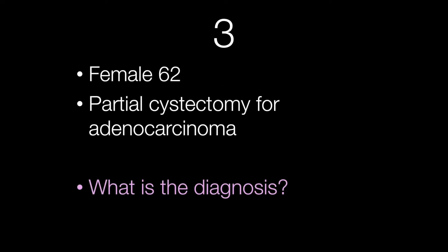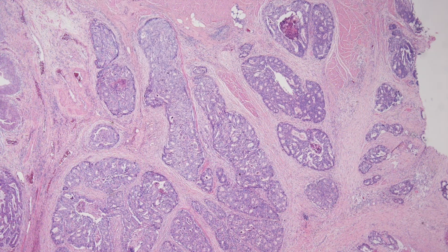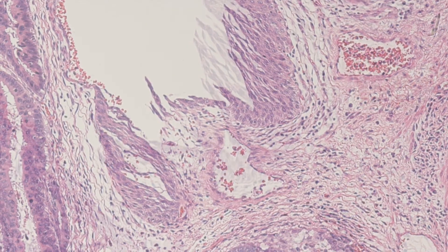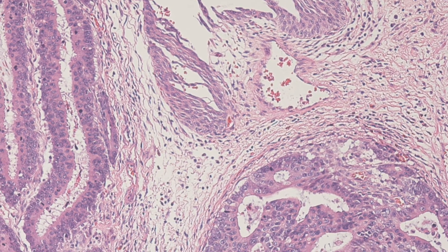Case number three is another female of 62 who had a partial cystectomy for adenocarcinoma. What is the diagnosis? This is a low power view. There is clearly tumour here, but is it arising from the urothelium? Here are a few more fields to assess the tumour.